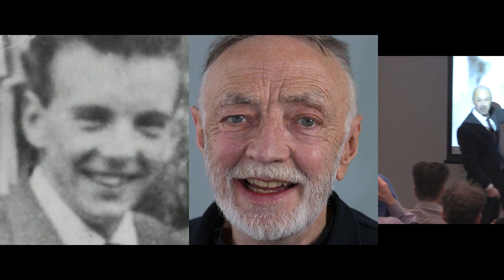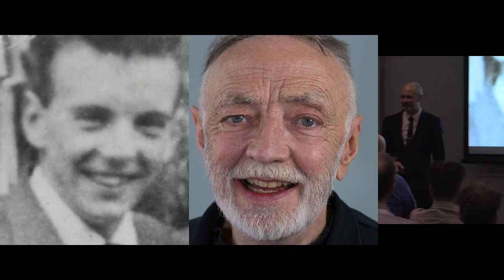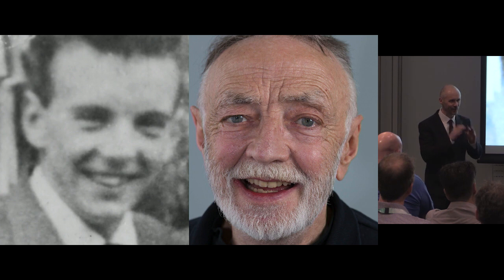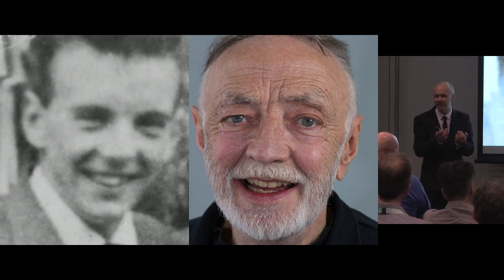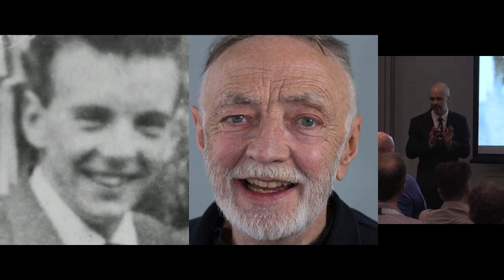And we looked at this and we thought, his brother's got a similar face shape to him, so why don't we use that as a reference to set the teeth up? So even on a really blurry, enlarged picture like that, we've got a load of detail that we can actually look at and copy. So we've got this incisor just stepped back there, and Rowan's done that. A nice wonky lower teeth. We love that. Straight lower front teeth just screams out denture. And if we just imbricate them a little bit, it breaks it up and it looks great.